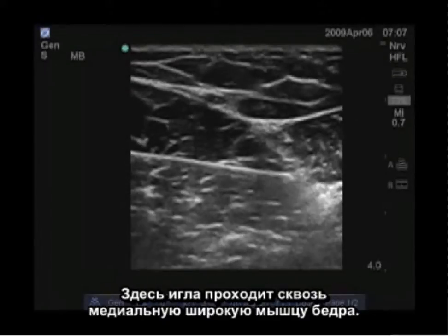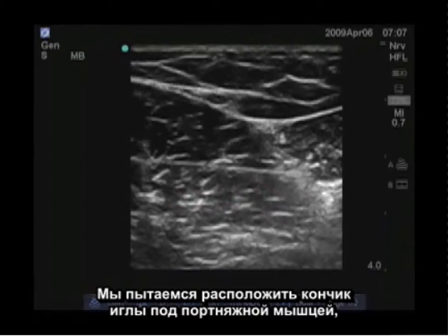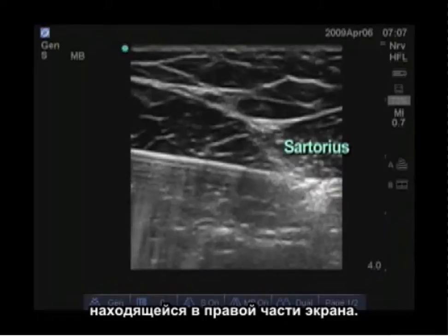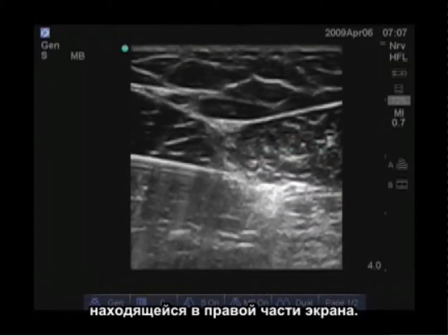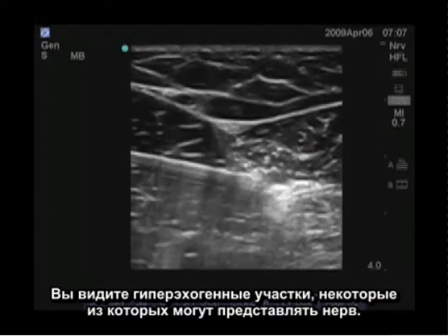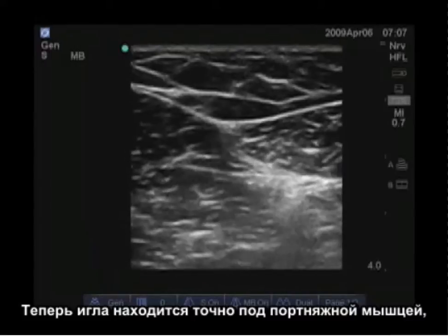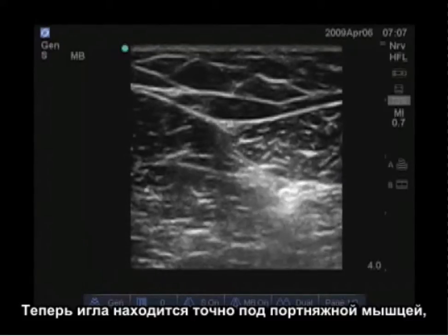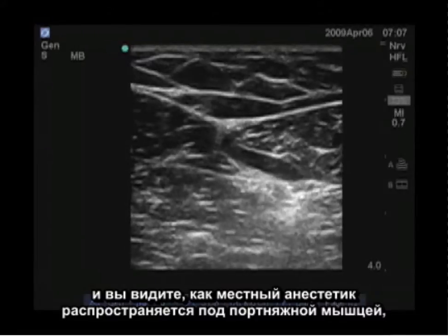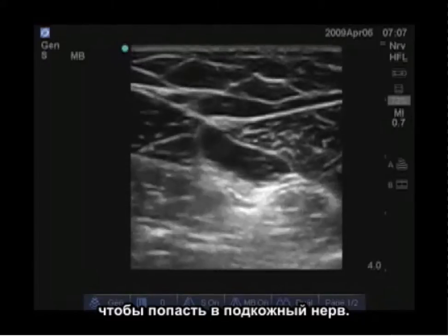Here our needle is advancing through the vastus medialis. We position the tip of the needle underneath the sartorius muscle, which is located to the right of the screen. You can see hyperechoic areas, some of which may represent the nerve. Our needle is now directly below the sartorius muscle and you can see the local anesthetic spreading below the sartorius muscle to track to the saphenous nerve.